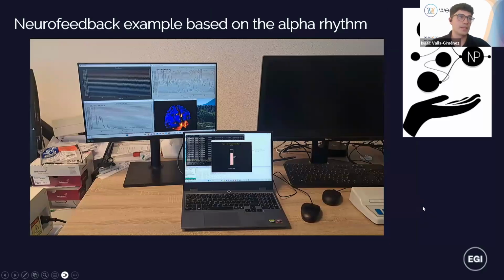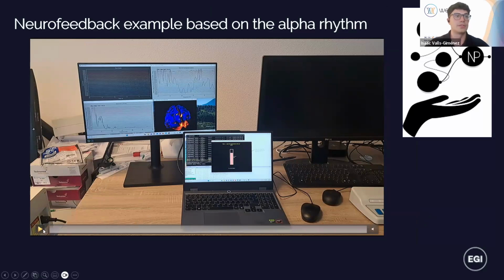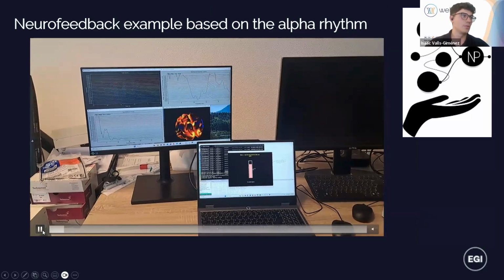Then we have a neurofeedback example here, which I mentioned earlier. NeuroPipe has an amazing amount of pipelines already created that you can customize yourself, and it's easy to set an LSL node that connects to your EGI AmpServer stream or your digital inputs stream as well. So once you call all of this in and you make some minor modifications maybe on the channels and some other things, you can do quite cool things.